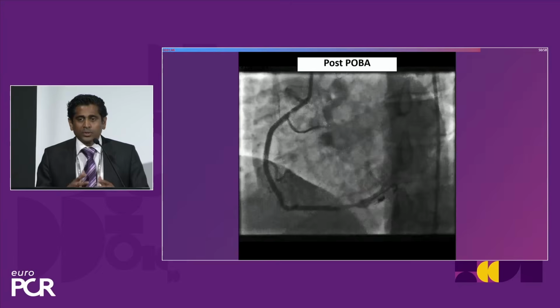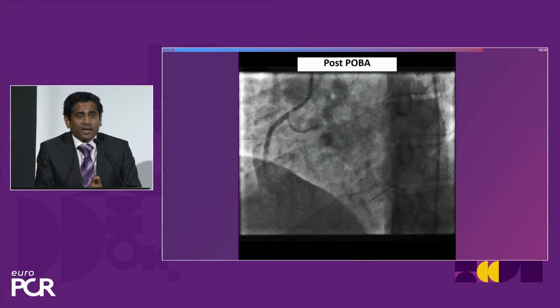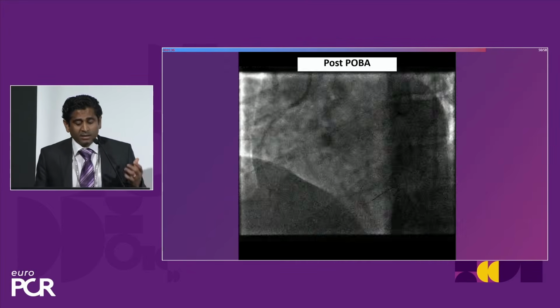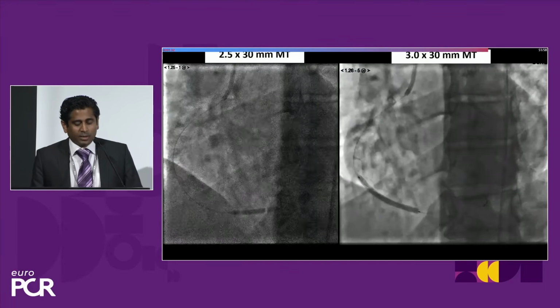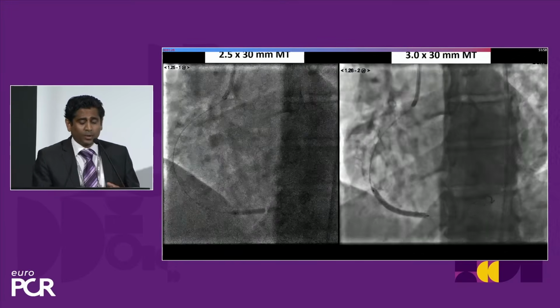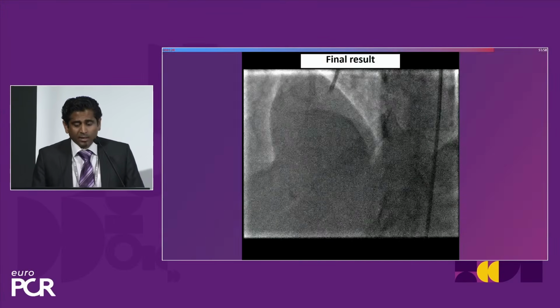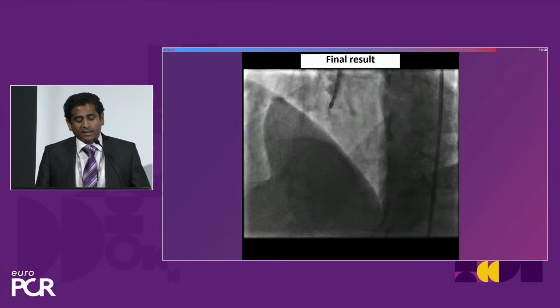Now, because there was so much thrombus, I was worried that putting a stent might cause slow flow. Second, I may undersize the stent because the artery caliber is probably underestimated in the setting of a STEMI. So obviously we used 2 DCBs here. I tend to use sirolimus balloons for acute MI because of the risk of slow flow from embolization of the particles from paclitaxel. And so this is the final result. So we stopped here. I know it doesn't look like a stent-like result.